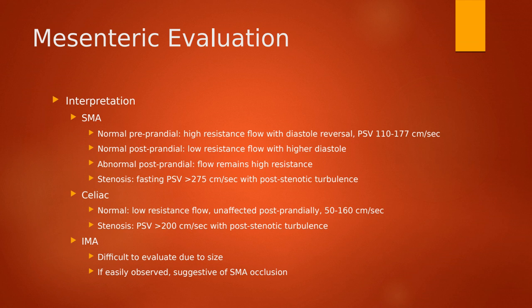This is also something too that when we're doing intra-abdominal or pelvic arterial evaluation, the peak systolic range is not going to be that 125, right? So we're going to see kind of a unique evaluation between the kidneys, between the liver, between the mesenteric arteries. That's not going to be the standard 125 for a stenosis or a question of a stenosis.